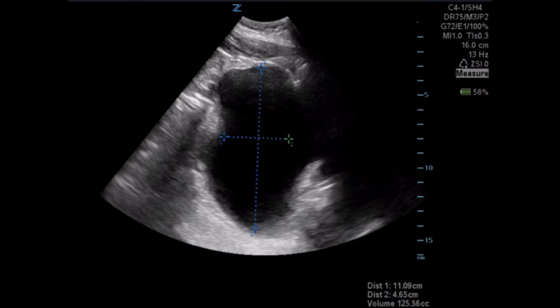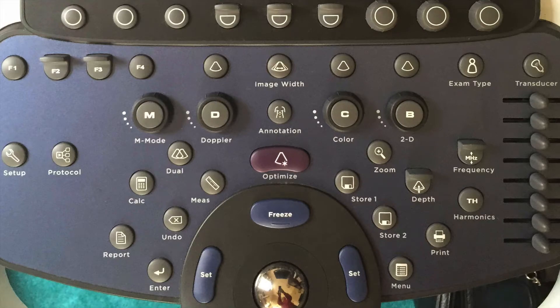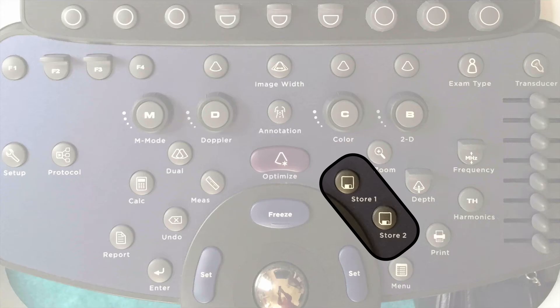We're going to press set and drag that across to give us our cranial to caudal measurement of the bladder. You can see we have distance one and distance two at the bottom. However, when we press enter, we are saving that measurement for the calculation but not saving the image — you have to use the store key to save the actual image.